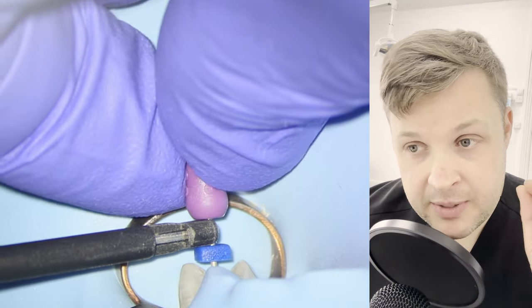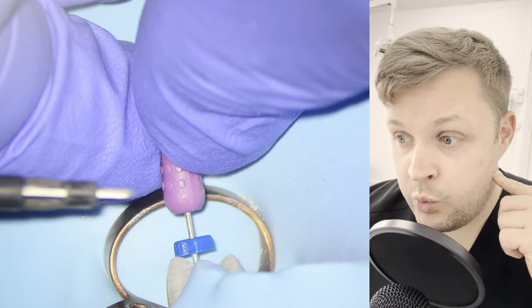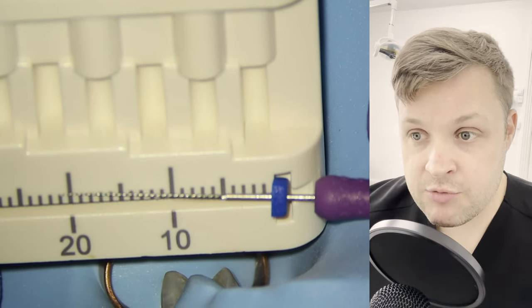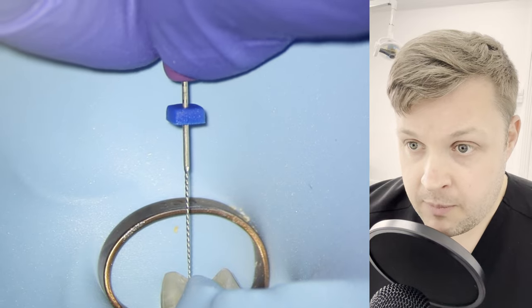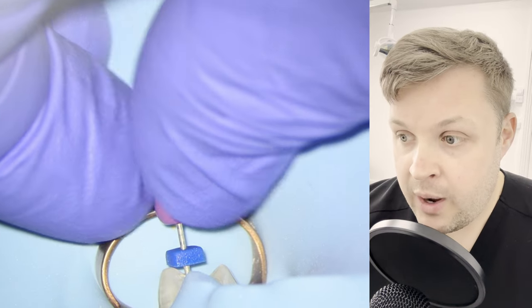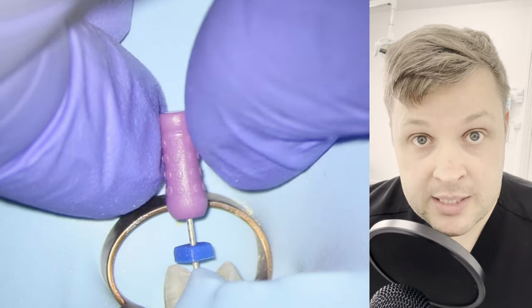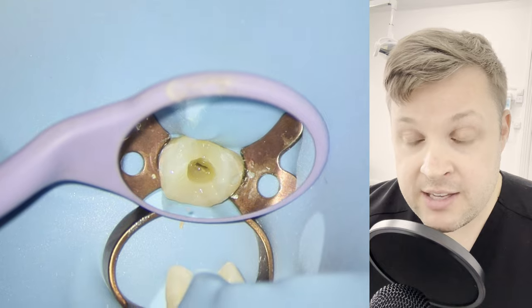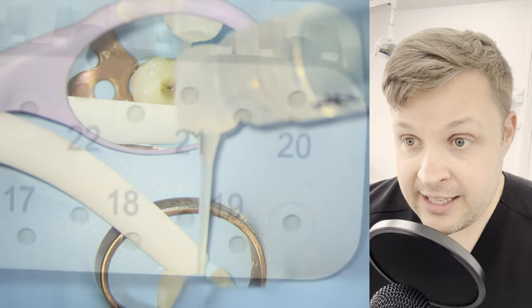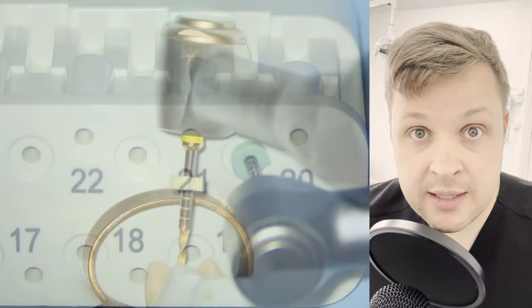Straight away when I'm thinking it's getting a bit tough, I'm thinking there's two canals — it's a bit tough to get to length. Do they join? That's in the back of my mind. We've just checked the measurement: the zero reading is 21mm. That's really important because we're going to shape with the hand file in the buccal canal to 21mm. But when we shape with our rotary files, we're not going to use 21 — we're going to step it back to 0.5mm to account for the apical constriction. So I'm going to use the rotary file at 20.5, not 21, and this will account for the apical constriction. Just gentle pecking — they say you should peck it three times, but sometimes I like to live on the edge a little bit.